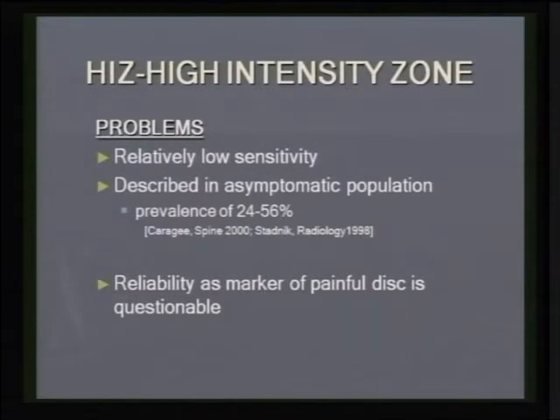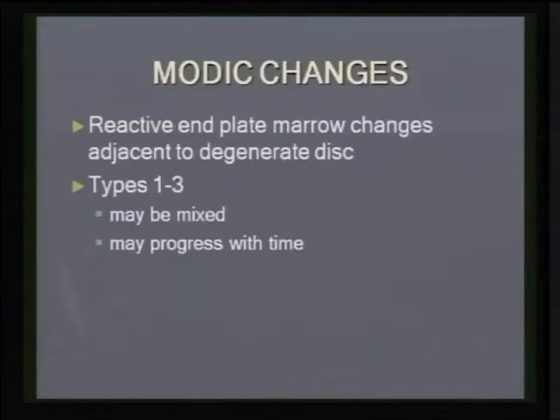Modic changes, we know these are reactive end plate changes adjacent to a degenerate disc. Three types are described, but they may be mixed, and they may commonly progress with time. So type 1 change may progress on healing to a type 2 change and so on.